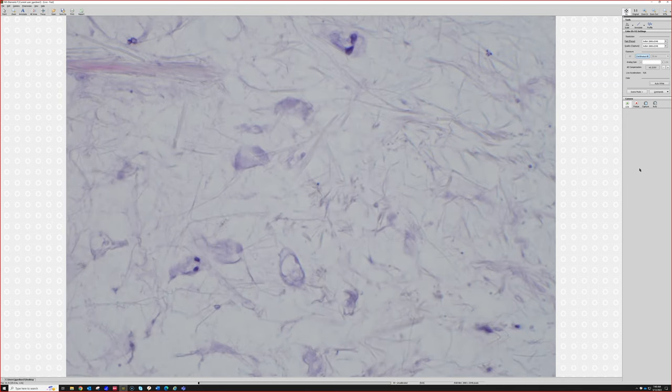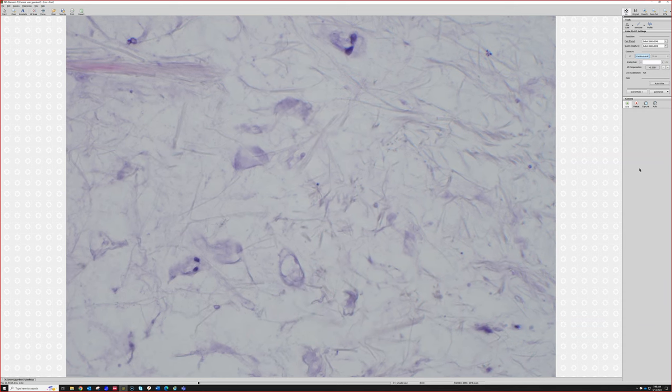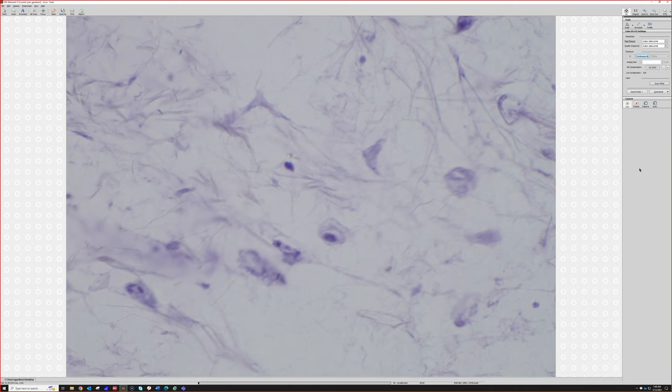The other thing you can sometimes see in this and in a lot of tumors that have a bunch of myxoid background, sometimes you'll see cells that have vacuoles filled with mucin. And when you see this in a cell that looks atypical, like in some sarcomas with myxoid change, we call them pseudolipoblasts. But you can see similar bubbly mucin-filled or myxoid-filled cells in myxomas. Also, they just don't have any nuclear atypia, okay?